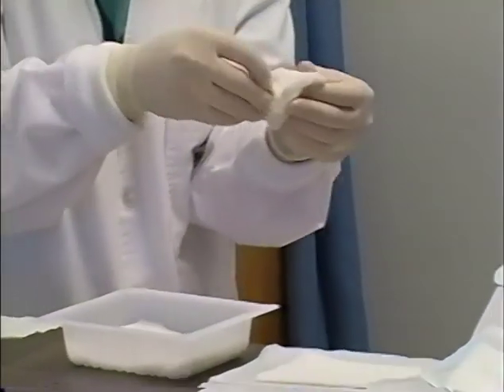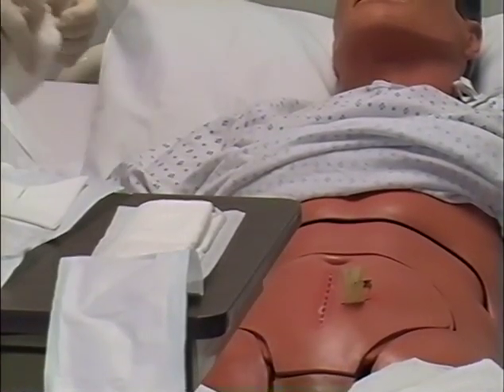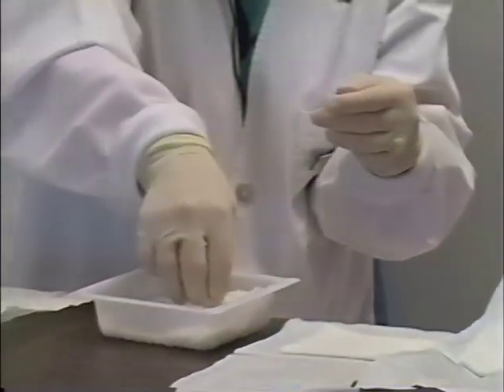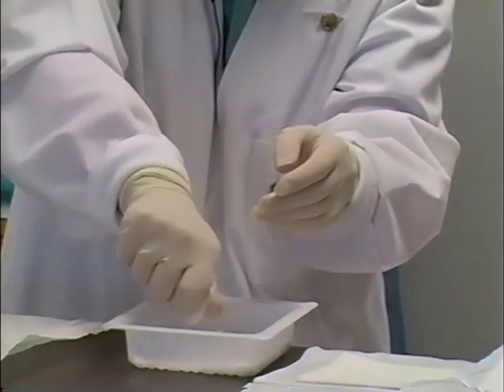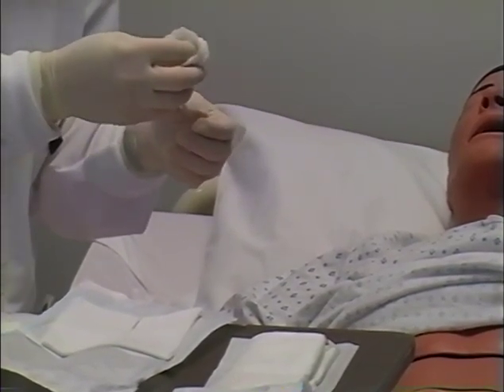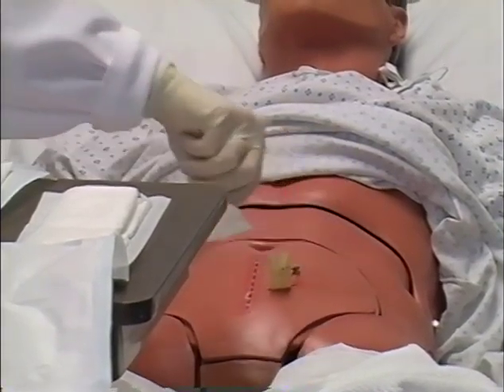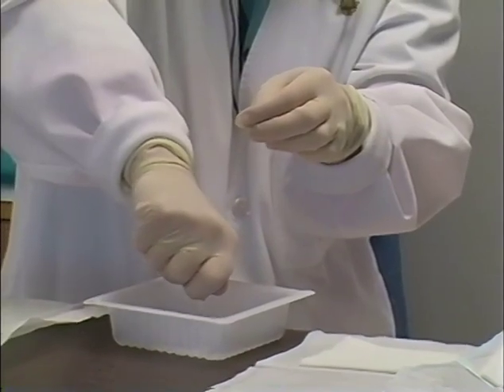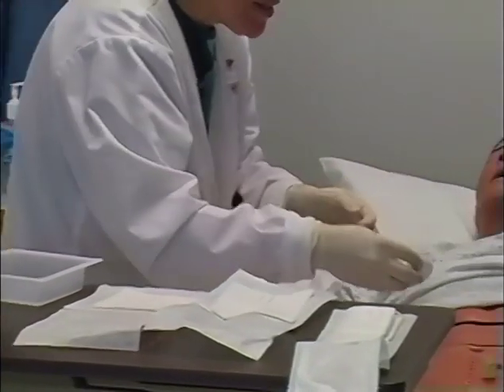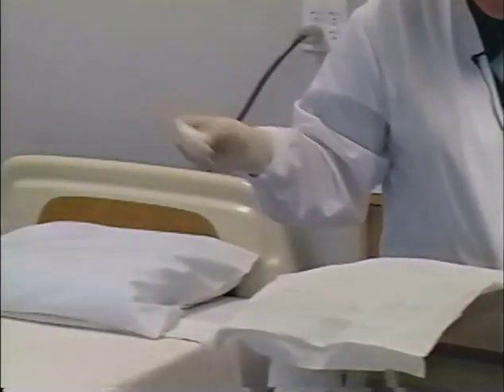My third sponge needs to clean the area on the side of the incision closest to me. I'm going to clean again — it might feel just a little cool. I need to be extremely gentle as I clean. The current research recommends that we not dry the tissue; if we leave the incision moist, it's supposed to promote healing. I've squeezed out this sponge and I'm now going to clean around the drain. The technique is to start at the incision, clean around the upper side of the drain first, and work out to the flank — gently wiping over that drain and safety pin as I go. My last sponge, I'm going to start at the incision and clean the bottom side of the drain working out toward the flank, then take that used sponge out around the sterile field.